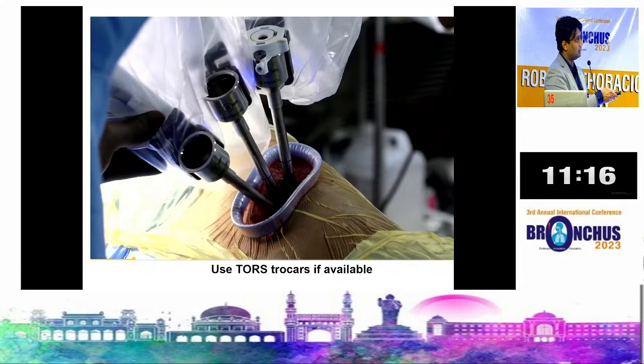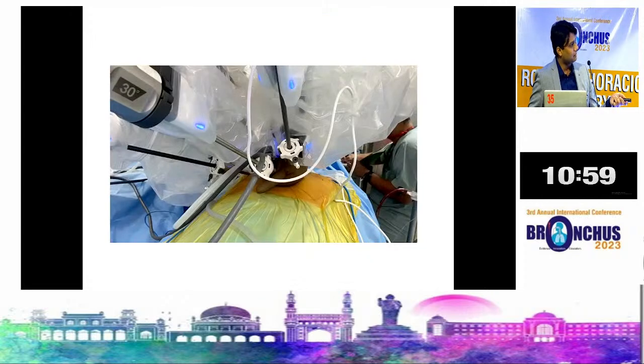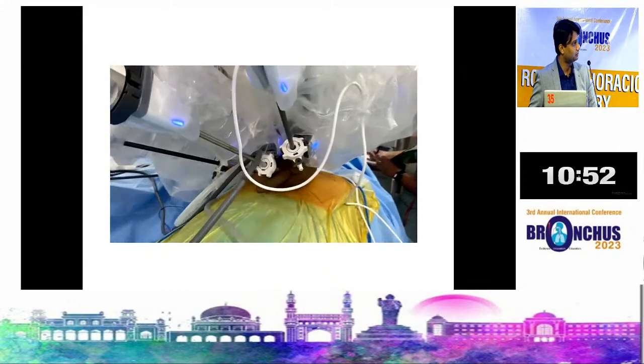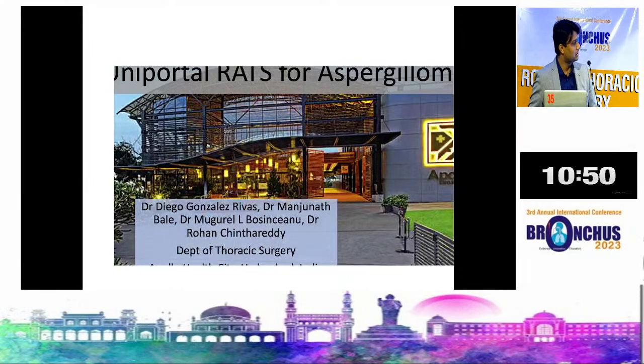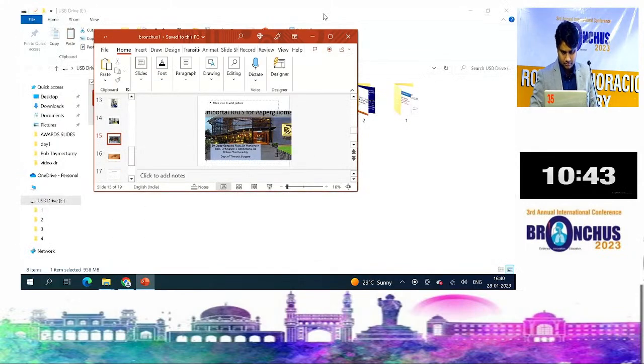In that, the bulkiness is reduced. They are much thinner, so we can use them easily. So the instrument clashing at this point, where the instruments go in and come out, becomes less. So this is how the instrumentation is when we start the procedure. This is where, when you want to use CO2, you use a glove and insert all the instruments through this and then proceed with the procedure. So this is just a video we actually presented at the HC. Sorry, I just want to move it up.